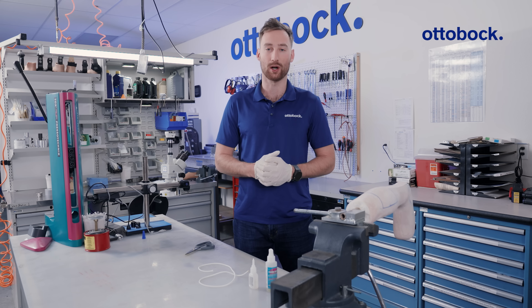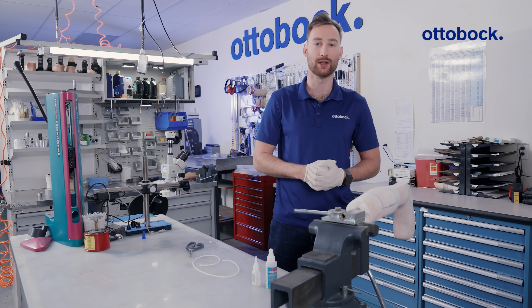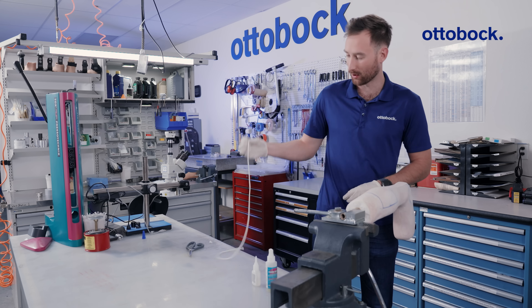In order to do this in your O&P workshop, all you will need is some adhesive, hair cord, scissors, and the positive model that you will use to fabricate your ankle-foot orthosis.